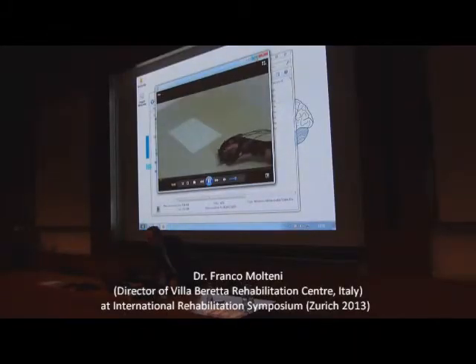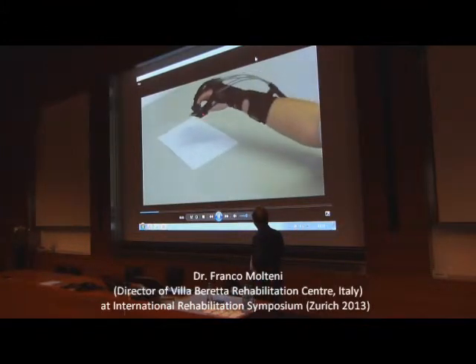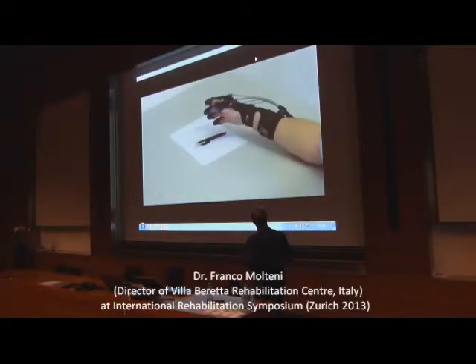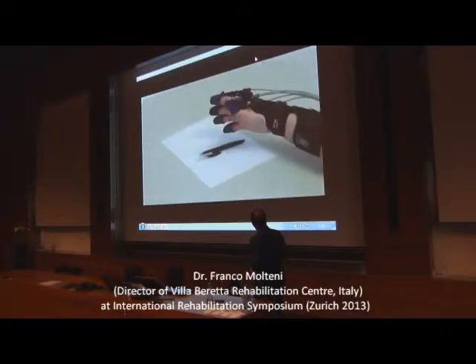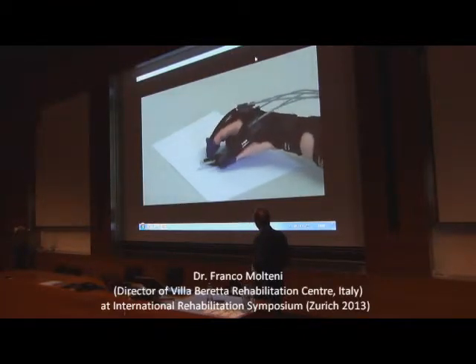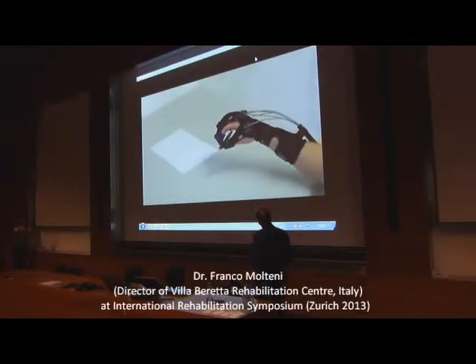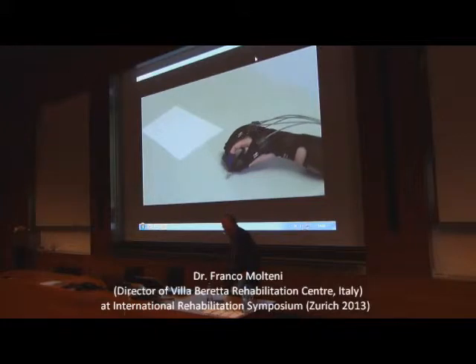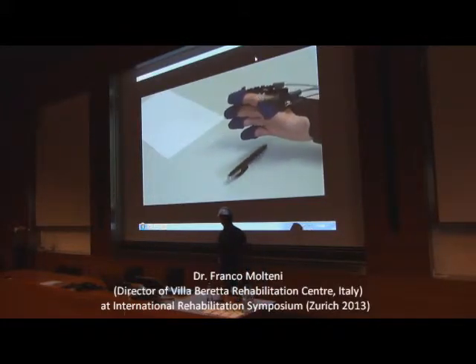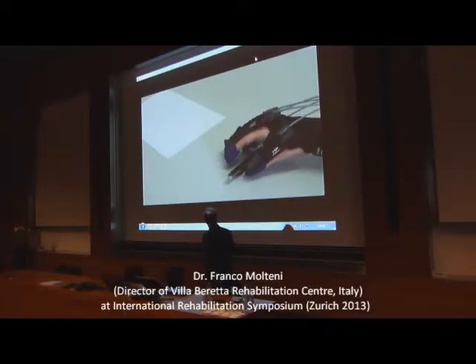The system can be used to take a pen, for example. In a situation like this, if the patient has the ability to control the shoulder and the elbow, the patient is able to do something related to real life, to try to control it, to use it and to plan. This means that we have a lot of different possibilities.